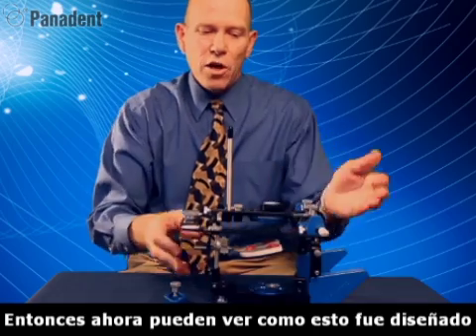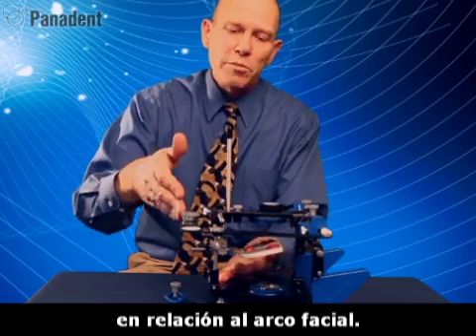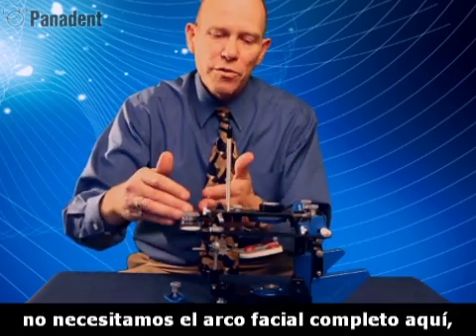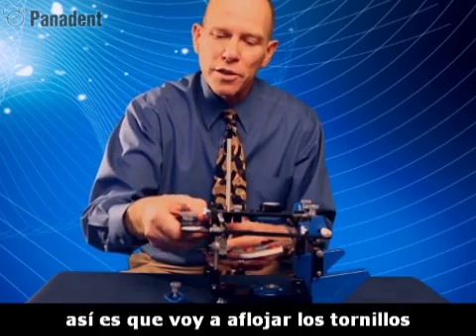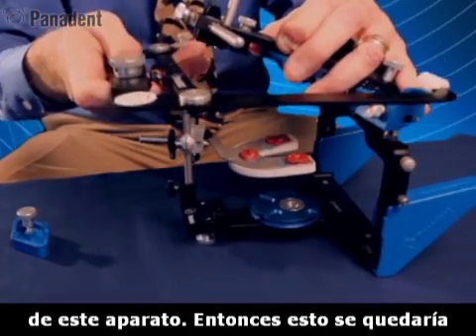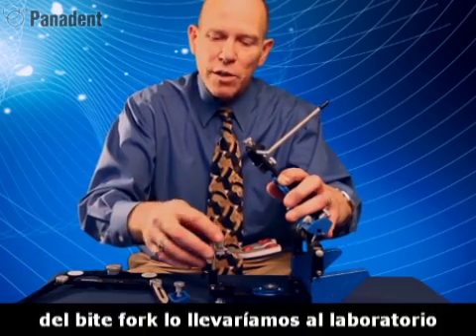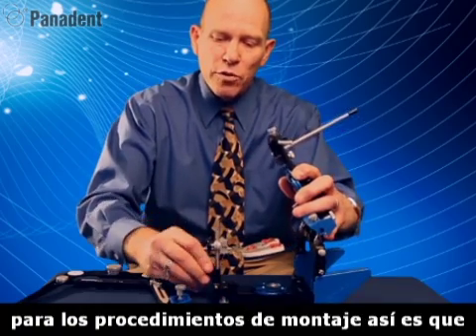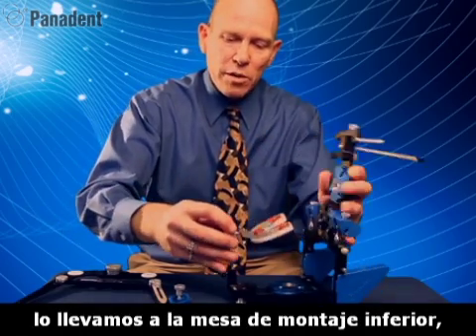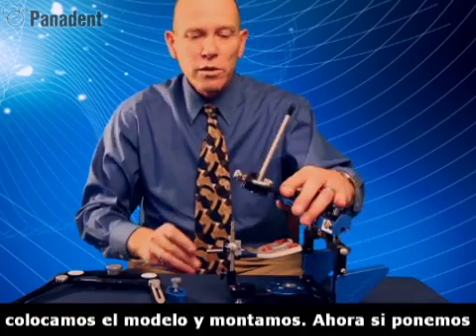Now you can see how this has all been engineered through the upper frame, down through the lower frame, through the fixture, back up to the face bow. We could open the frame, add a model, add some plaster and mount. But we really don't need the whole face bow here anymore. I can loosen the screw and thumb screw and remove the face bow from this apparatus. This is what would stay in the operatory, and only the bite fork assembly would come to the laboratory for mounting procedures. We would detach this from the face bow, come to the mounting fixture, drop it in place, tighten the screw, add our model and mount.